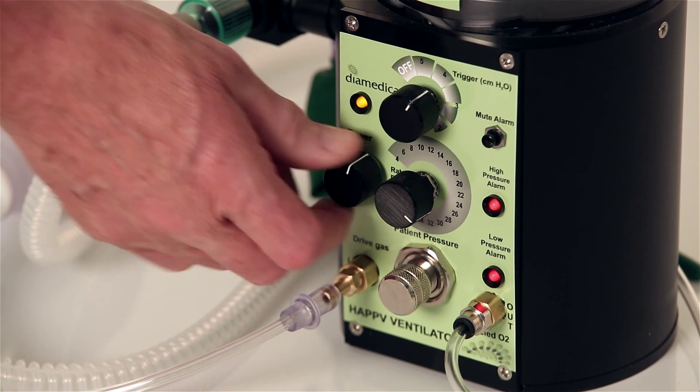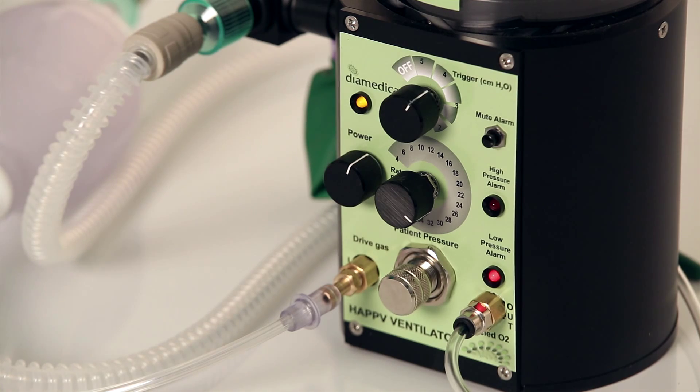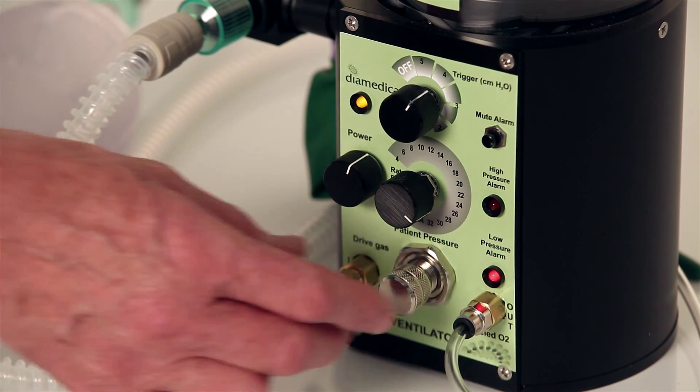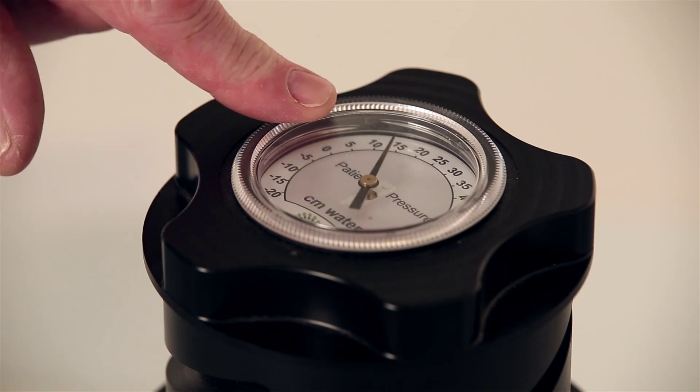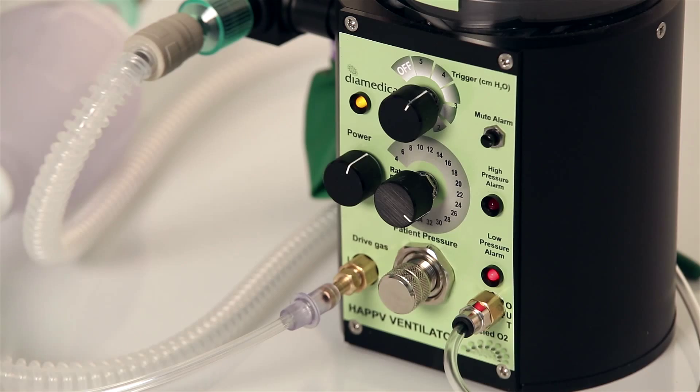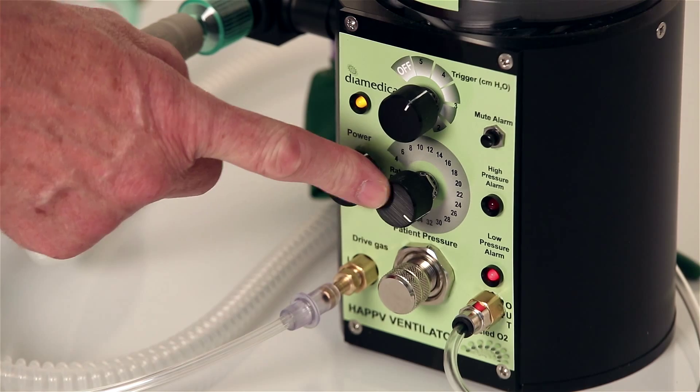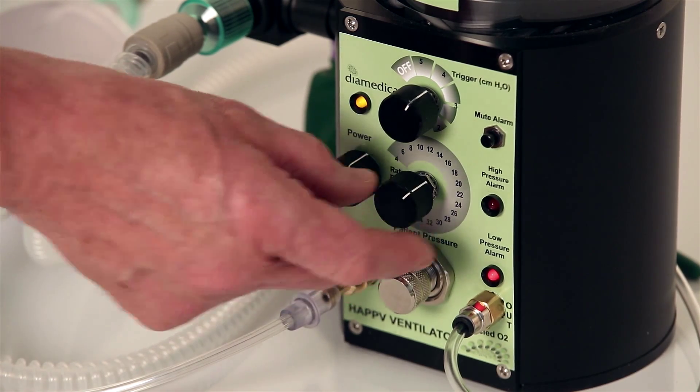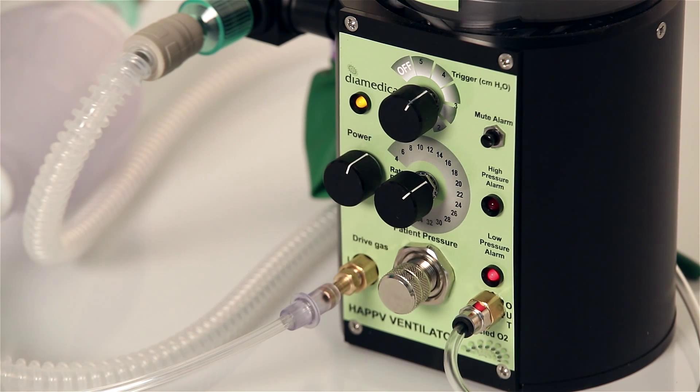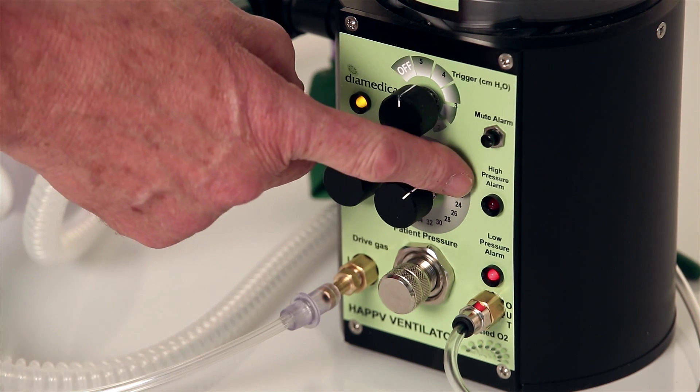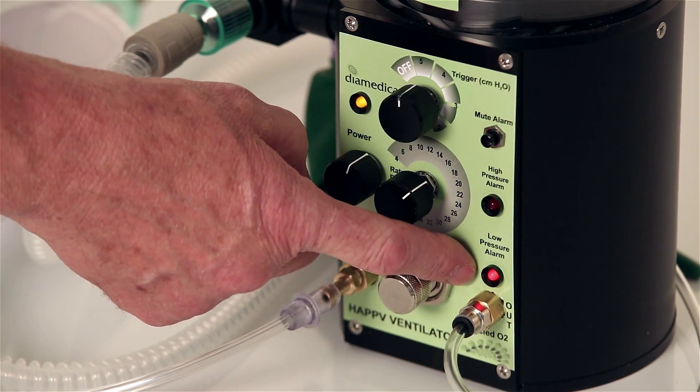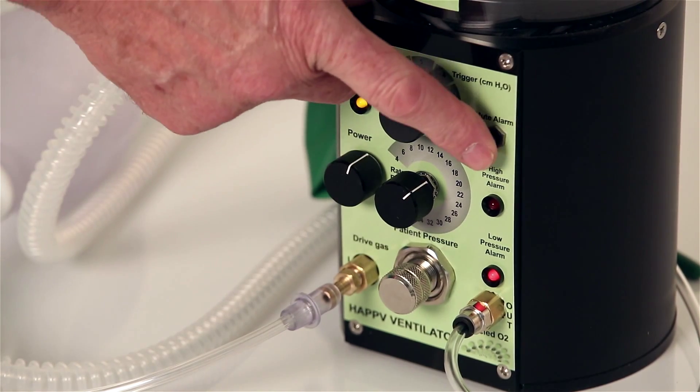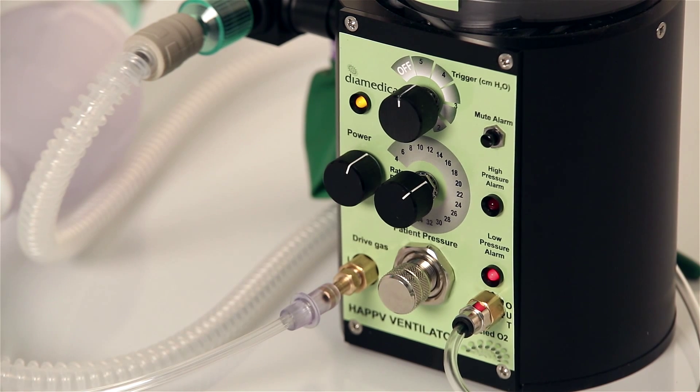There is an on-off control with a power-on light and a patient pressure control with the pressure gauge mounted in the top of the helix screw. There is a breaths per minute control that will provide a rate from 4 to 40 breaths per minute by simply turning it to the desired setting and a triggered breathing control to assist weaning or to provide pressure support. There is an alarm for high pressure and low pressure or disconnect alarm with a mute for the audible low pressure alarm.